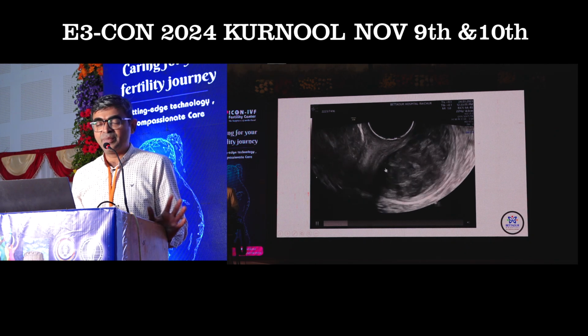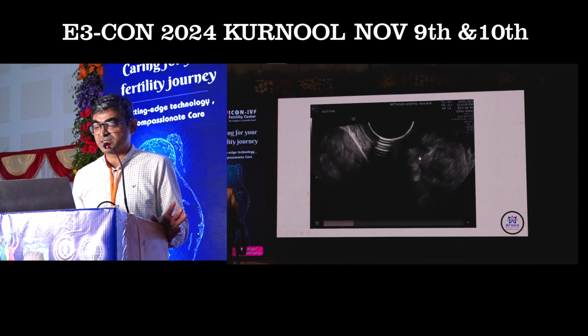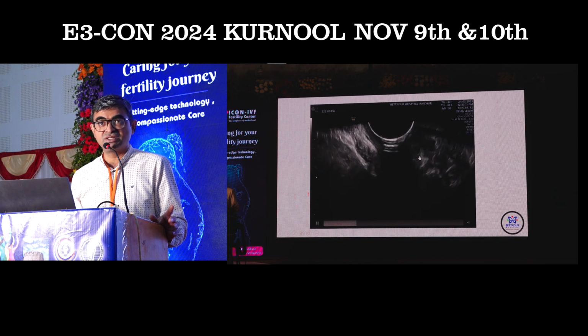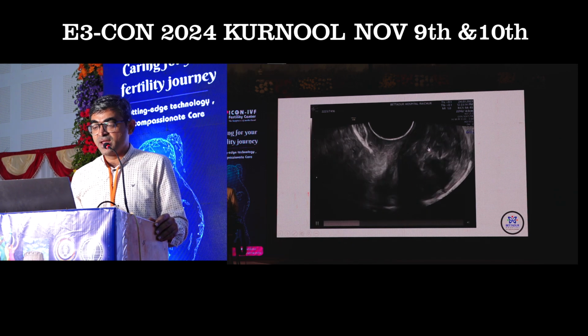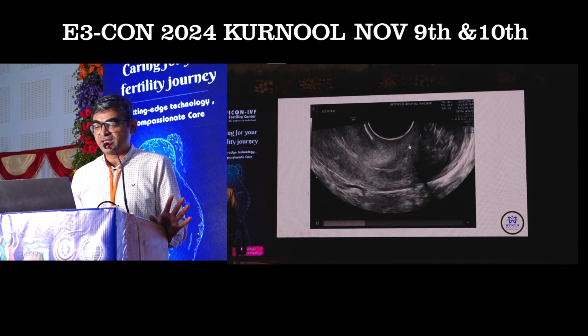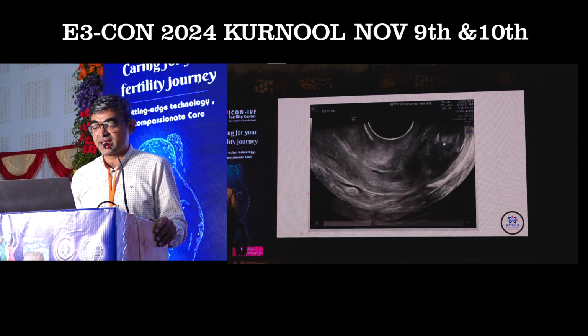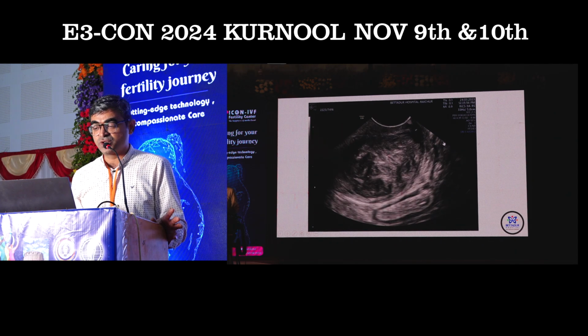It depends again on the presentation that patient might present. You are able to appreciate this is the endocervical canal. This is the posterior lip of cervix having the large cervical fibroid. So fibroid, I'll skip the vascularity and all. We have the classical capsular uptake and all. It may have internal vascularity as well, but capsular aspect is more specific.